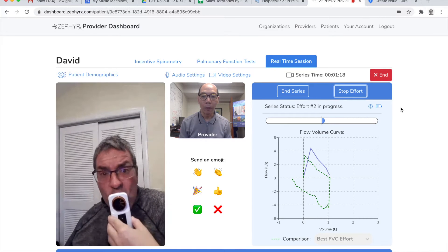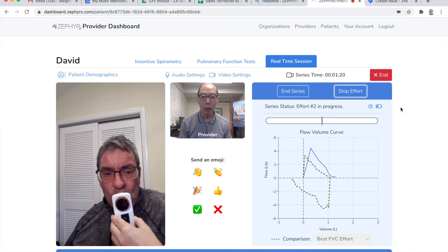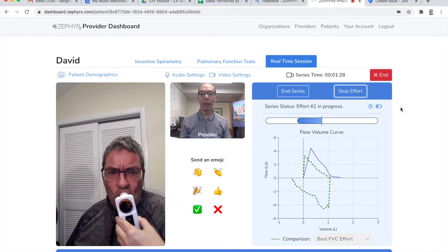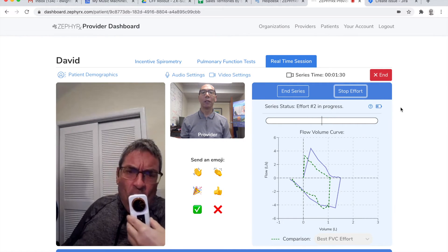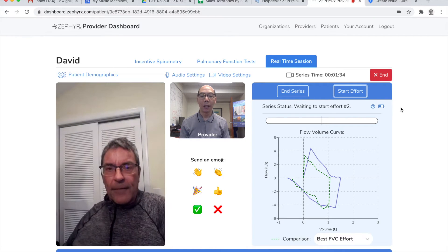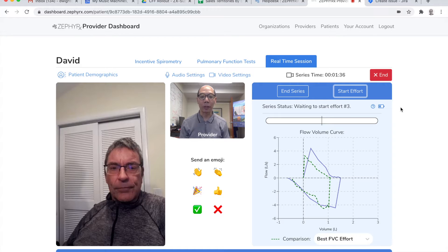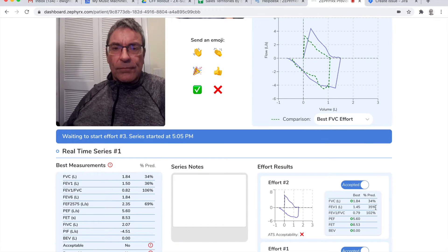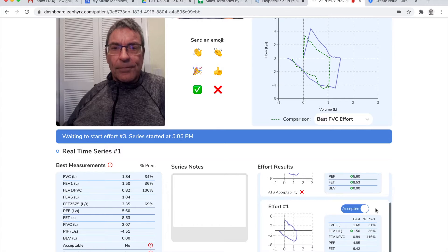Ready? Blow. Keep on going, keep on going. Okay. And now inhale. That's very good. That's really nice. I see your results — effort one and effort two.